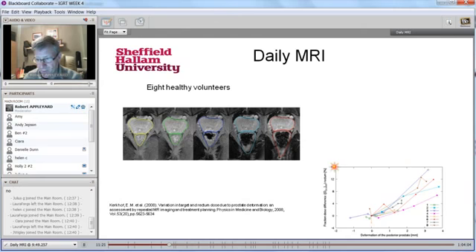So on this axis here we've got the fractional dose difference for the anterior rectal wall, and on this axis we've got the deformation of the prostate. As the prostate is deformed, and this is in millimeters, you can see that if it is deformed up to 3 millimeters, we're seeing fractional differences in the dose to the anterior rectal wall in the region of 12 to 15%. That's very significant. You might be aware of this, but MR demonstrates it beautifully. It's a very good way of illustrating the potential benefit of using daily MR guidance for certain categories of patients. So far we've been able to see that for cervix and for prostate in feasibility studies before we've even got MR-Linacs.